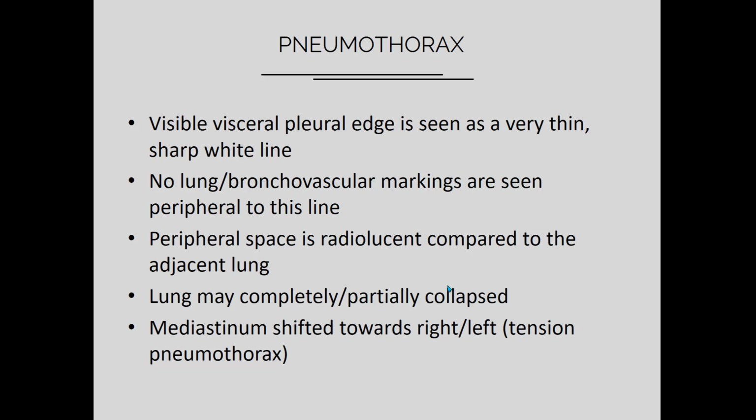Okay, mediastinum shifted towards right or left. Naturally, that depends on your specific investigation. In case of tension pneumothorax, if that is plain pneumothorax, actually the mediastinum remains at its own place.